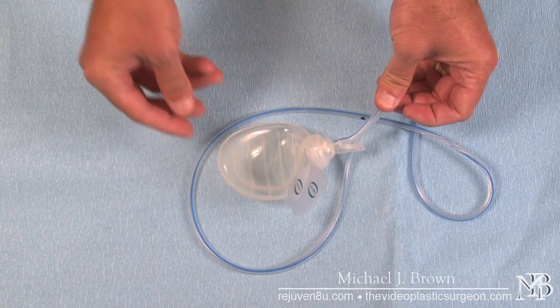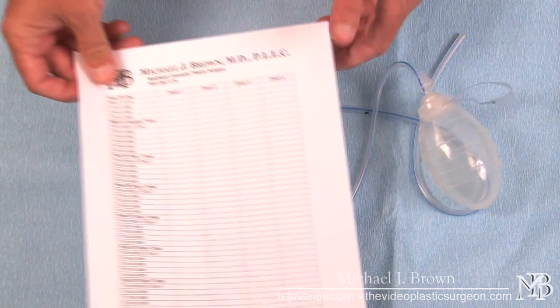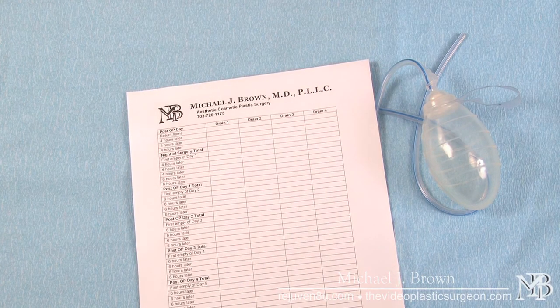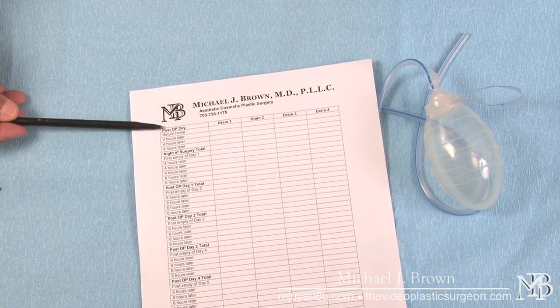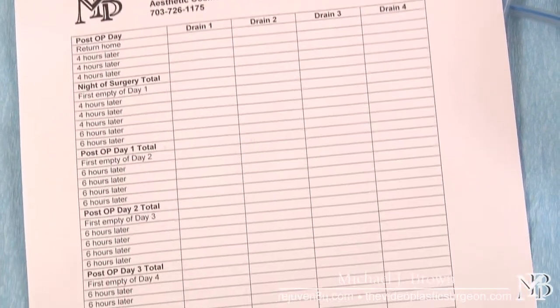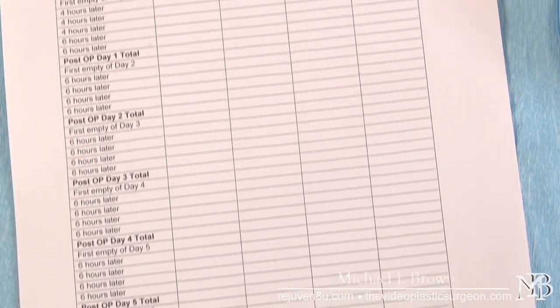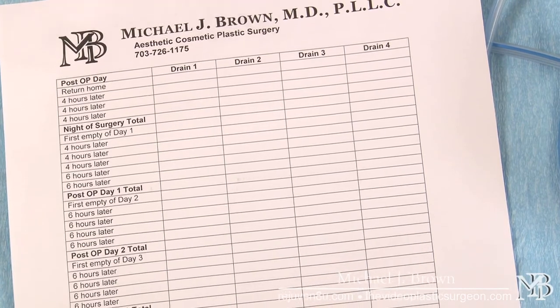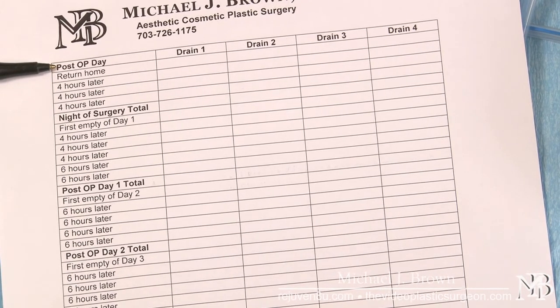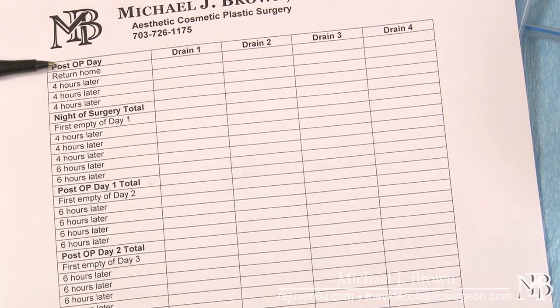Every four hours on the first day you will record the outputs, and to do that you would use a drain output sheet. What you see here is the day of surgery and subsequent days recorded on one side of the paper, as well as the number of drains a particular patient might have. Most patients will only have one or two drains depending on the extent of surgery and whether I'm operating on one side or two sides. On the day of surgery, the frequency of emptying the drain is about every four hours, to make sure the drain is adequately suctioning at all times.